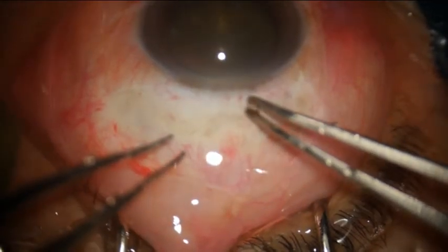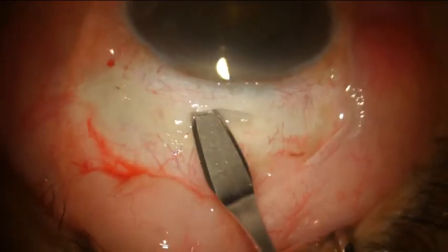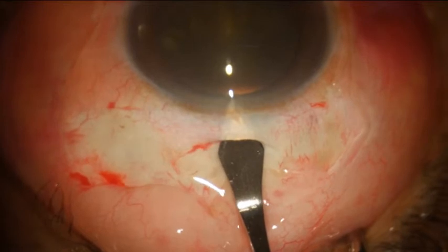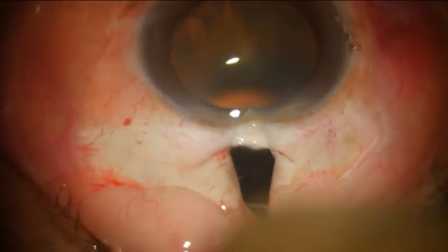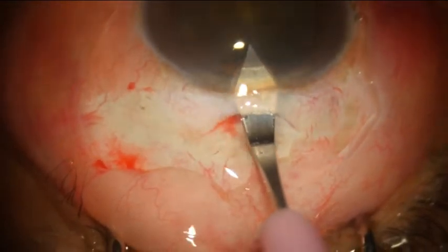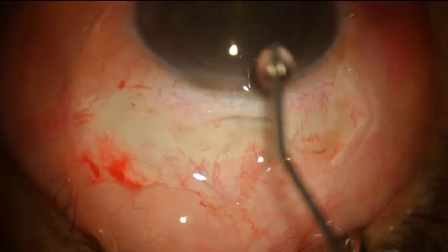The bleeders are cauterized with very light cauteries. Approximately a 6 mm incision is made with a blunt keratome, and then the eye is entered with a 2.8 mm sharp keratome.